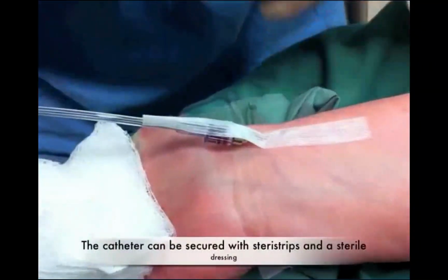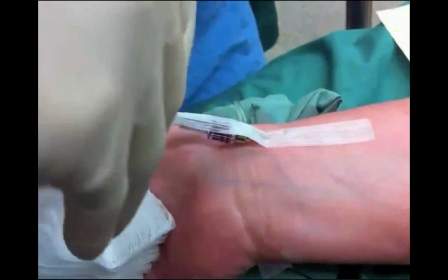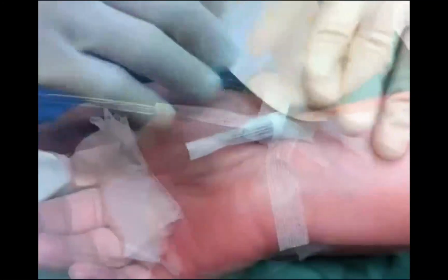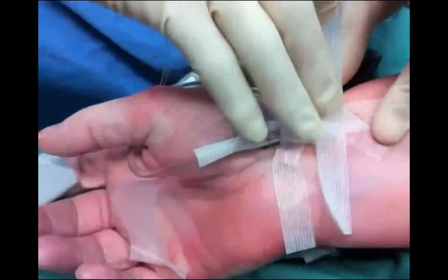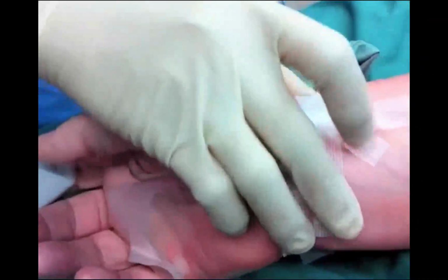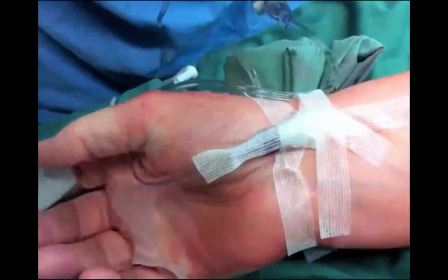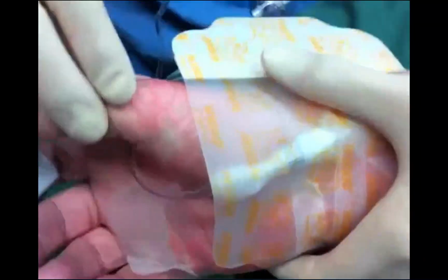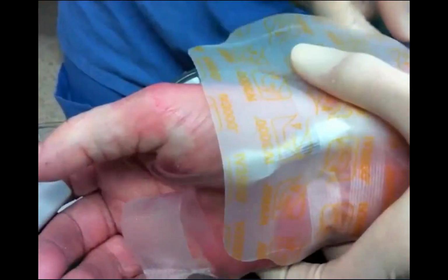A guide wire is then inserted through the catheter into the arterial lumen and the catheter advanced over the wire into the artery. There are several methods of securing an arterial catheter. However this is done, it is important to maintain sterility. Ideally, the point of insertion of the catheter at the skin should remain visible.